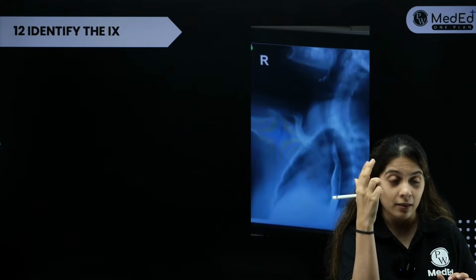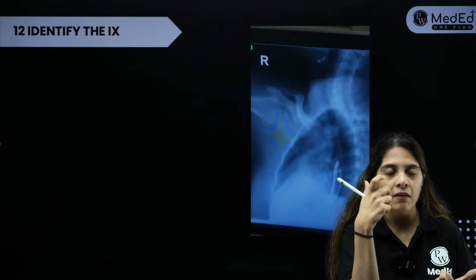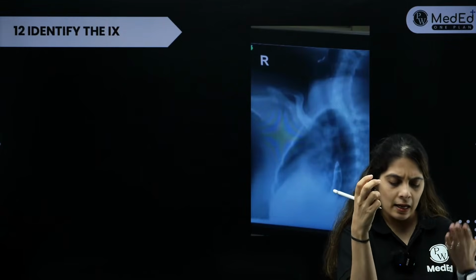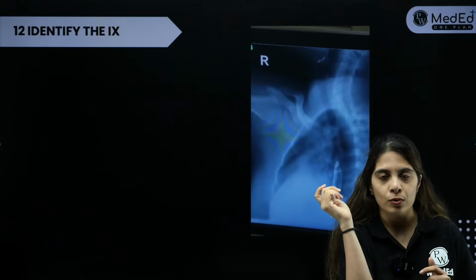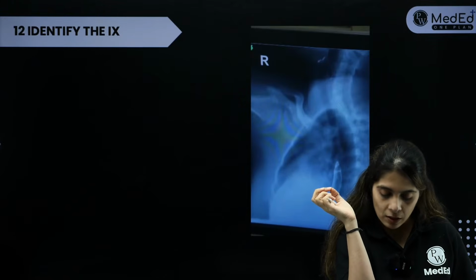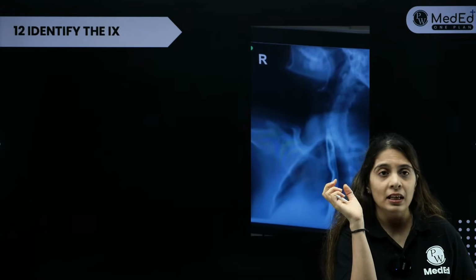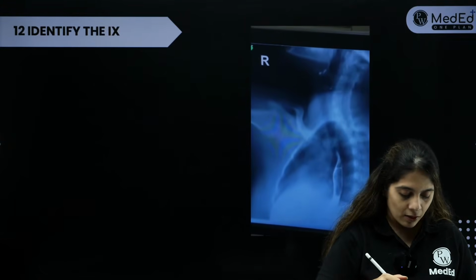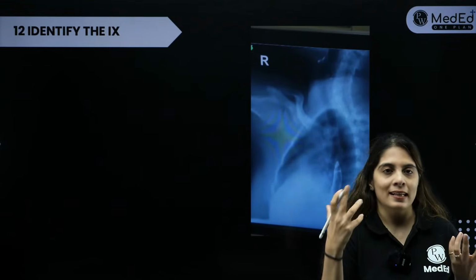Here we have given the person the barium, we have made that suspension and we have asked the person to swallow the barium, and he has very well gulped the barium, and we are imaging it in live fluoroscopy, right? Is this absolutely abnormal or normal? Can someone tell me? This is absolutely normal barium. Some of them may get confused. What is this brackish area that you are seeing? That is nothing but air.